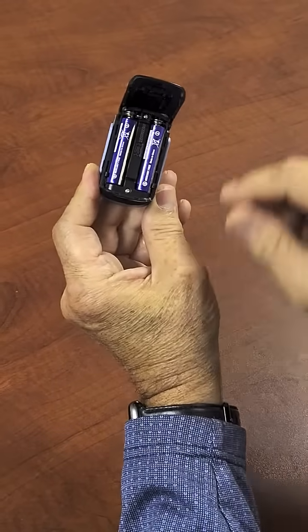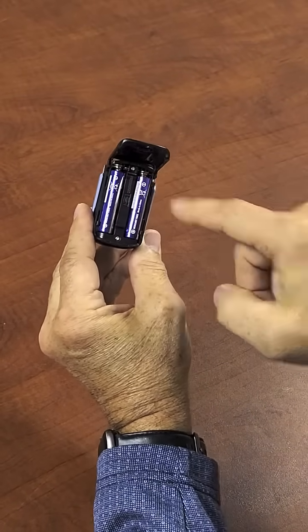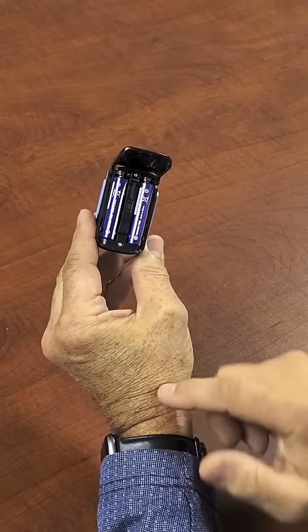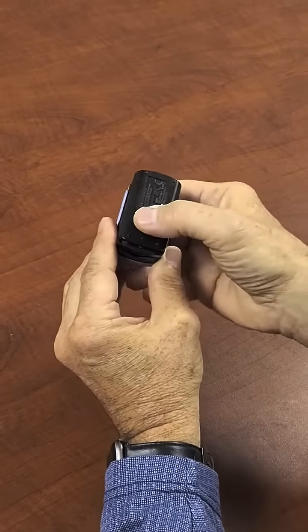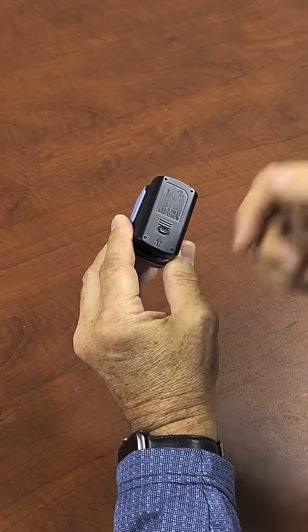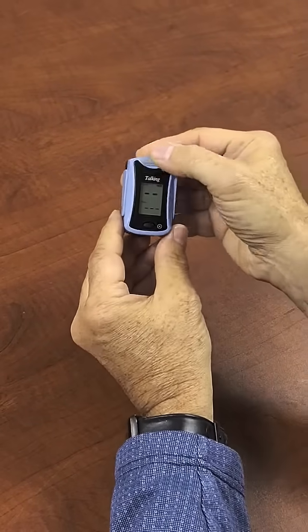The batteries have to go facing the same direction. The negative end of the battery goes against the springs up here. Positive end is at this side. Close it up, slide it back a little bit to lock it into place, and we're ready to go again.